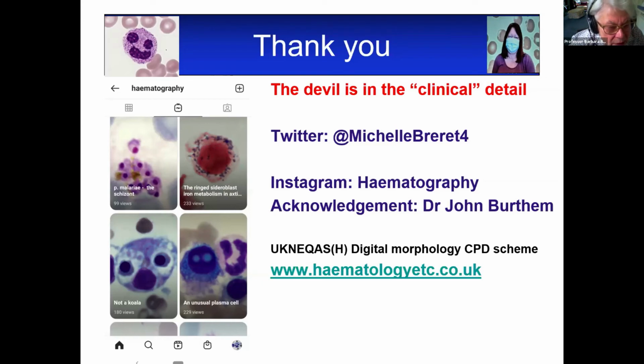And there's an international group that advises on morphological terminology, and they suggest using the terms atypical lymphocyte appears reactive or atypical lymphocyte suspect neoplastic, because sometimes you can get a cell which, in something like mantle cell lymphoma, for example, doesn't look all that dissimilar to the ones you would get in a viral infection. So I think the first thing to do is to notice them, call them atypical lymphocytes, and then think, looking at the overall picture, what is most likely, and suggest that possibility.